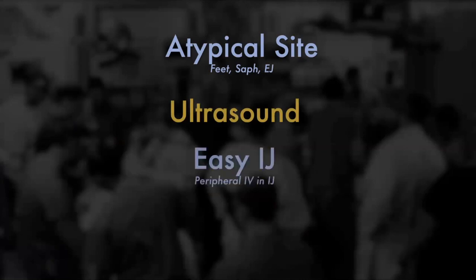When the nurse says they can't get an IV, first just try a regular nursing level peripheral IV and look in a couple of your atypical sites. Look in the feet. Go ahead in babies, try and poke and get that SAF. And then look at the EJ. Lay your patient flat and put them in Trendelenburg and see if you can grab it that way. After that, grab your ultrasound, or if your patient's really crumping and they're not going to have anything peripherally, go for the easy IJ. Take a long ultrasound length IV catheter and just stick it in the IJ like you're doing a central line. Put a little Tegaderm over the ultrasound probe, put some sterile jelly on, and go to town.